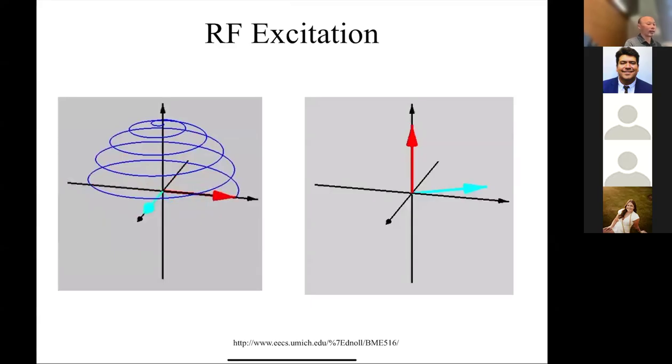Okay. Now let's just say you're a bit off. You're running a little too fast or too slow. You're running faster than the merry-go-round or slower than the merry-go-round. Then you're just not going to be as effective, right? Your pulls are not timed correctly. Okay. And so in that case, the magnetization stays where it wants to be. Okay. So the key is with RF excitation, we want to apply our B1 field at the right frequency. Okay.